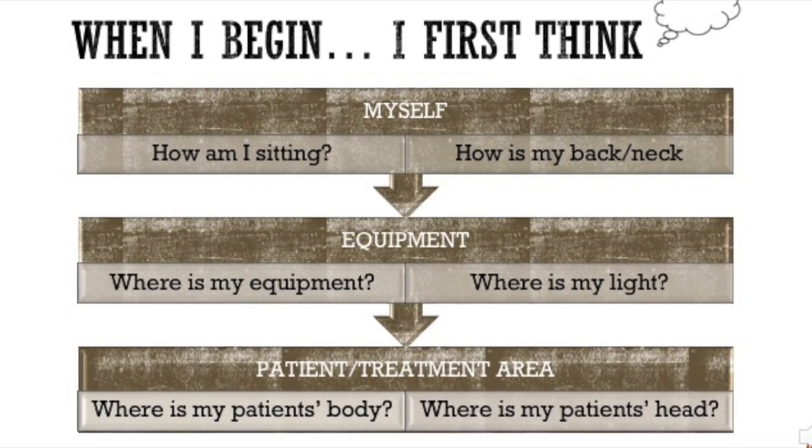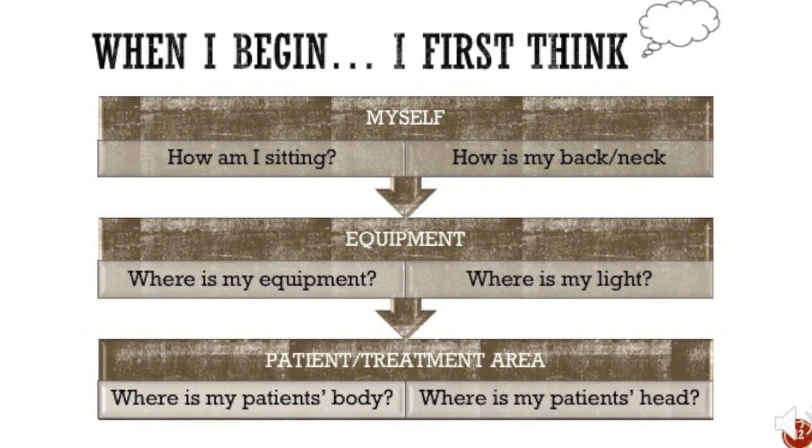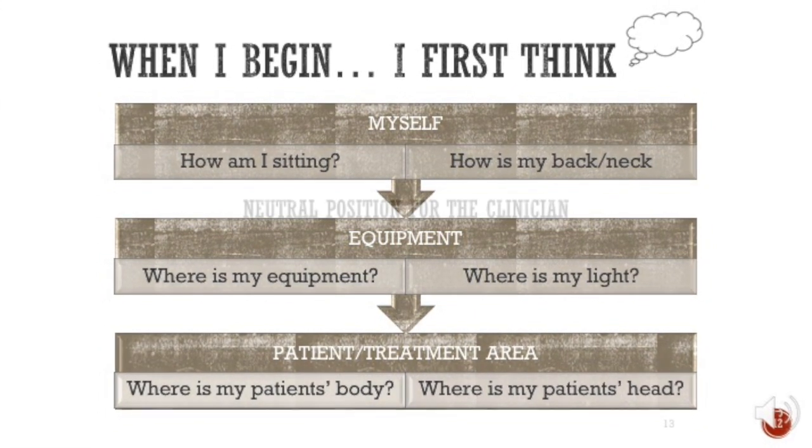How am I sitting? How is my back and neck? Where is my equipment? Is it too high? Where is my light? Where is my patient's body? And where is my patient's head?